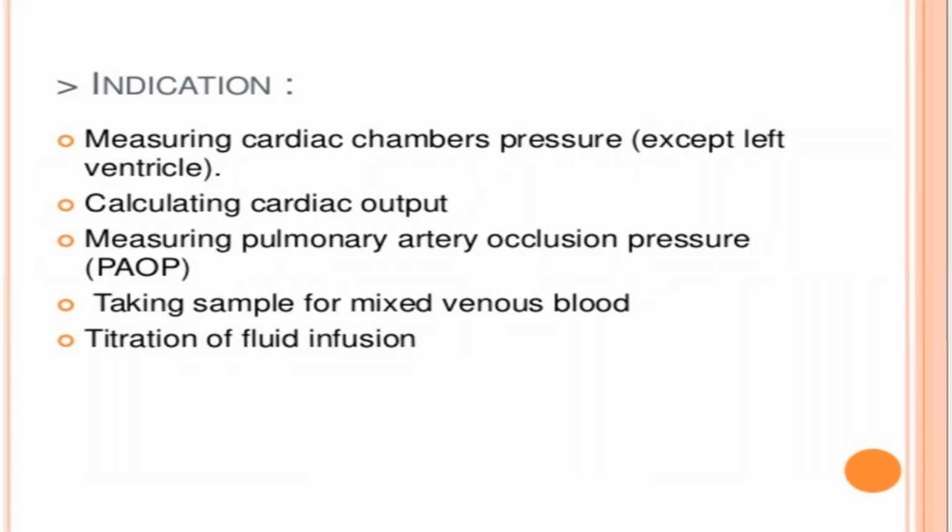Indications: measuring cardiac chamber pressures except left ventricle pressure, calculating cardiac output, measuring pulmonary artery occlusion pressure, taking samples for mixed venous blood, and titration of fluid infusion.